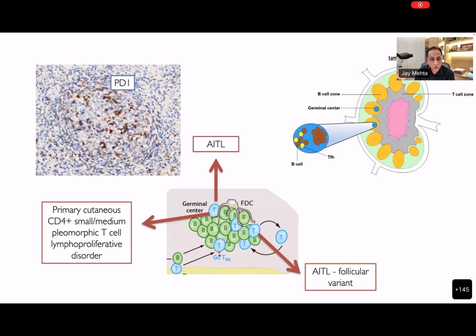You get this bunch of B cells. In this blue are the T cells. And they're all arranged around these dendritic processes of the follicular dendritic cells. And that's where the reaction occurs. The antigen is presented by the T cell on the dendritic processes of the FDC meshworks, and that's where the B cell and the T cell come and live together and react, and they give an immune reaction.